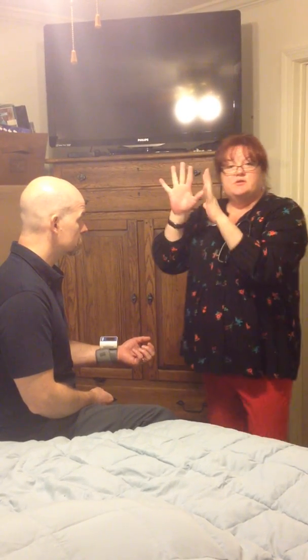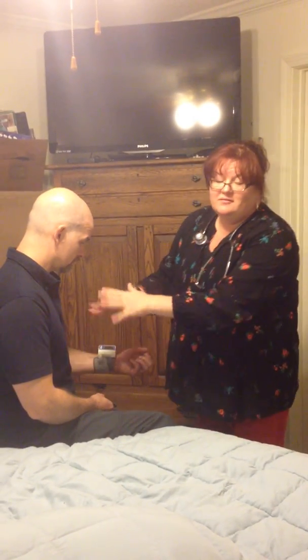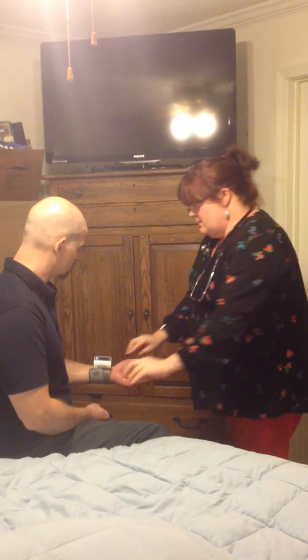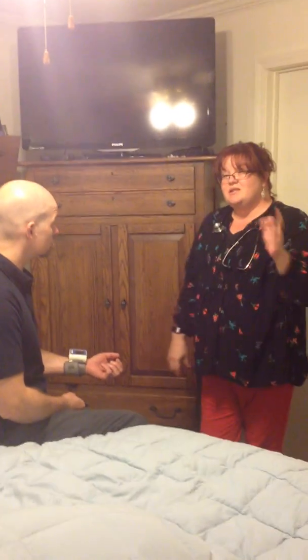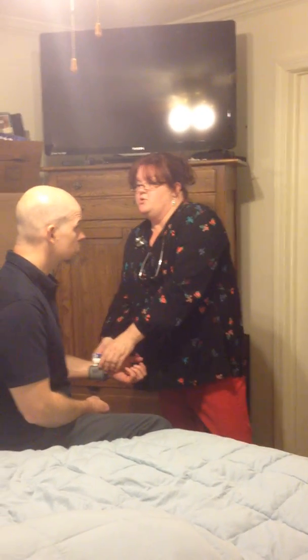I'm going to check the temperature. His temperature feels normal across the top of his forehead. He also feels normal on his appendages. So I'm actually checking temperature throughout. I'm going to go ahead and check his pulses real quick. His blood pressure is 147/93, which is a little bit high. I know you're pretty fit usually, and this is not your typical blood pressure.